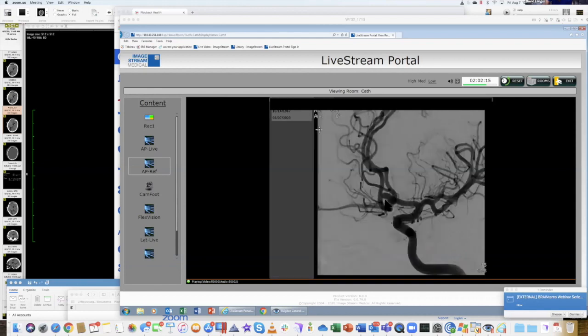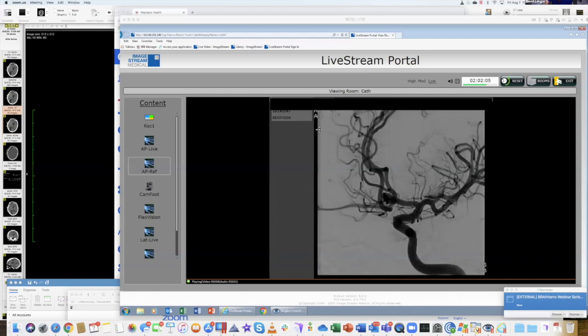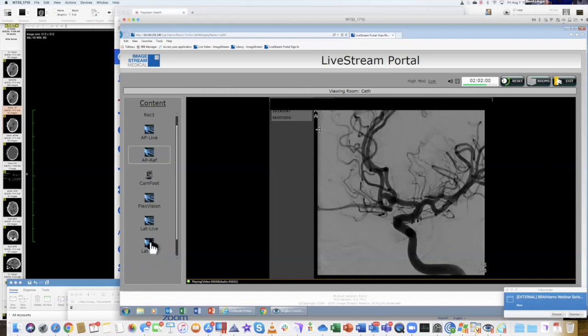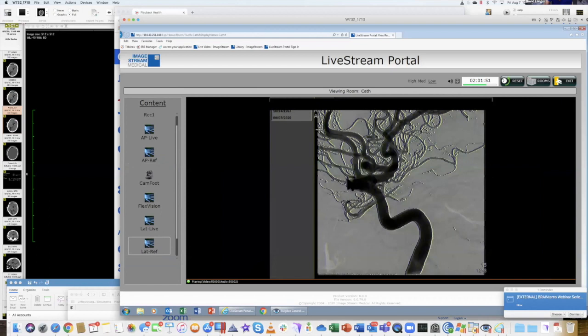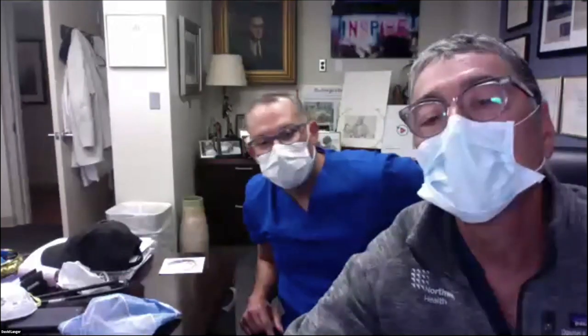So that was a critical part, to look at the neck, but this view was great for us to see the distal end of the aneurysm, so that we could see where the aneurysm ended. The other view that we use, for some reason this is not showing great here. But the other view was better to look at the neck, at the origin of the aneurysm.